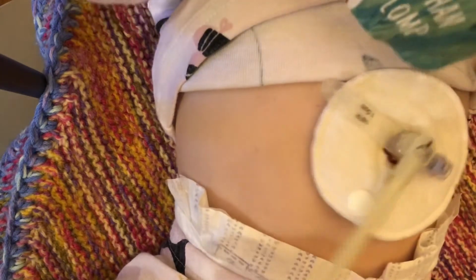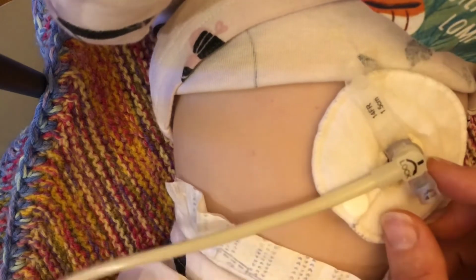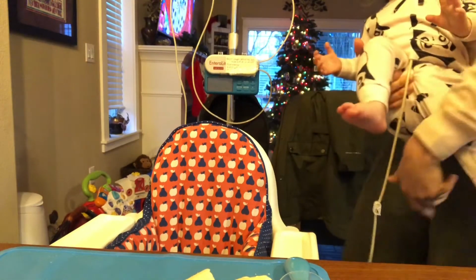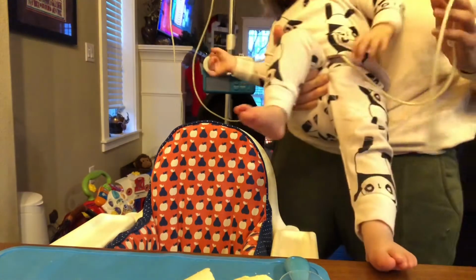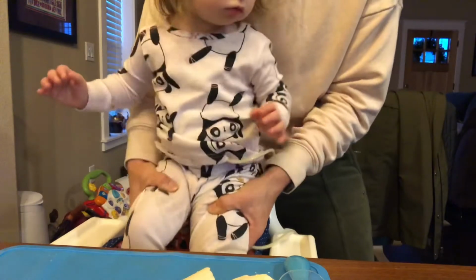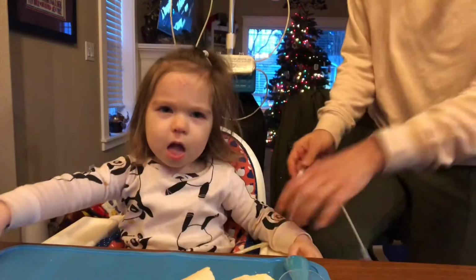Now, when she has her tube connected, it's extremely important that you protect her tube so it doesn't snag on anything, because if it snags and pulls, it does hurt her. So just keep it in your hand so that it's not going to get snagged on anything. So here's Patricia, finally her face, with her tube connected. Remember, don't let it pull on anything. We just make sure that it's always to the side before we put her in so that she's not sitting on it. And then we just get her in her high chair. There we go. Making sure it's not pulling.